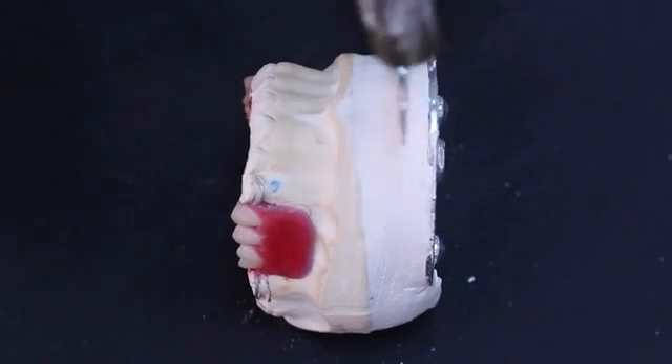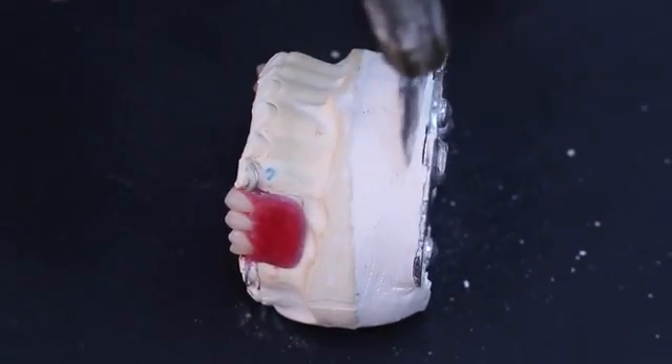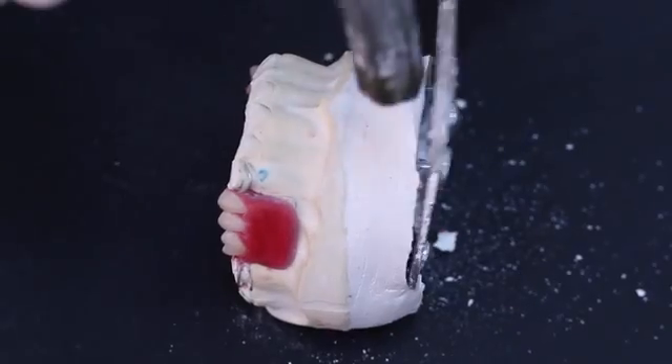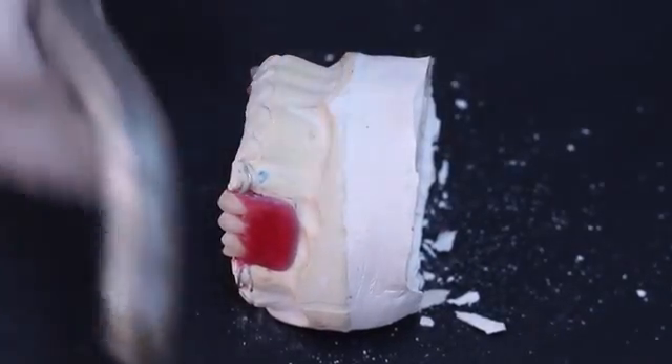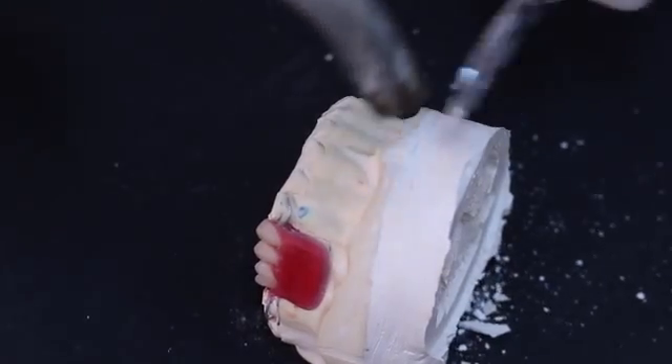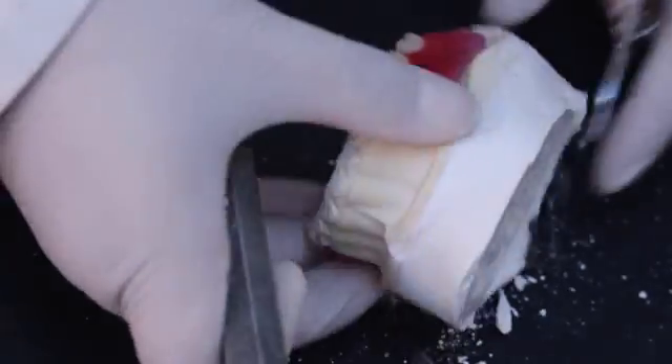Separate the master cast from the mounting plate by using a point-of-force application using a gypsum knife and gently tapping the hammer at the junction of the mounting plate and the mounting plaster, followed by tapping at the junction of the master cast and the mounting plaster.